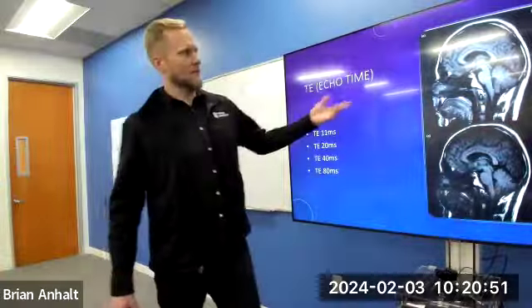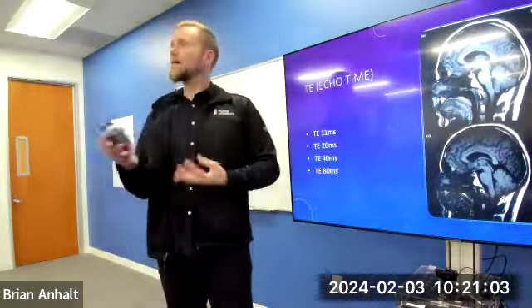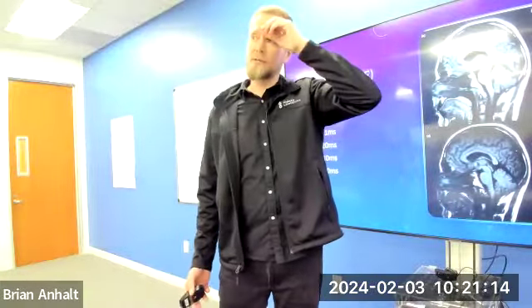But look at what happens to the, well, this would be the best contrast. We're not worried. We're mixing T2 and T1 information here, which just produces no signal. But in a T1 weighted image with that short TR anyway, that's already lowering our signal. We want to have the TE as low as possible to give us the best signal possible with that short TR and short TE.